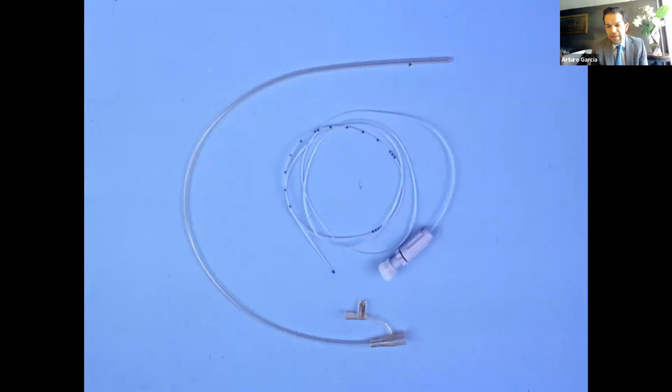They have a single lumen UPP catheter, and they have a peridural catheter, which is fed into the holes of the UPP catheter, as you can see here. You put the tip inside the holes, and then you feed both catheters inside. Once you get urine and you know you are inside the bladder, you dislodge the peridural catheter, and after you do this, you feed the rest of the peridural catheter inside.